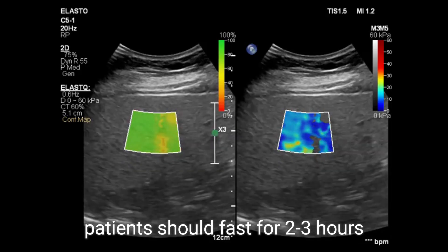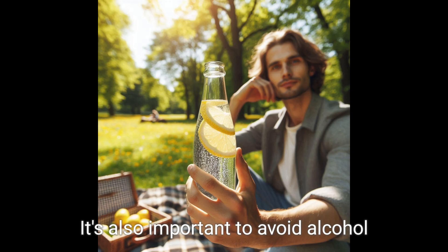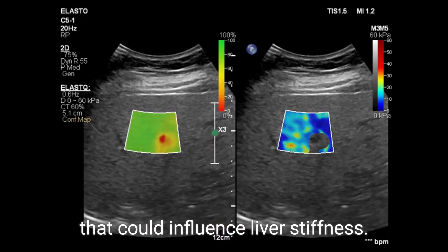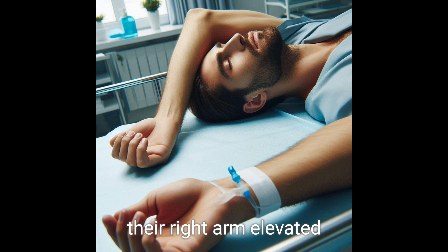To perform a Fibroscan, patients should fast for two to three hours beforehand to minimize the effects of food on liver stiffness. It's also important to avoid alcohol and medications that could influence liver stiffness.